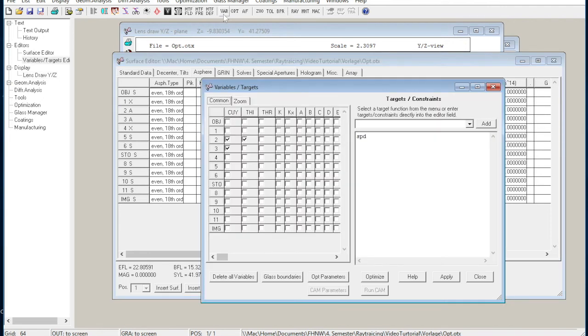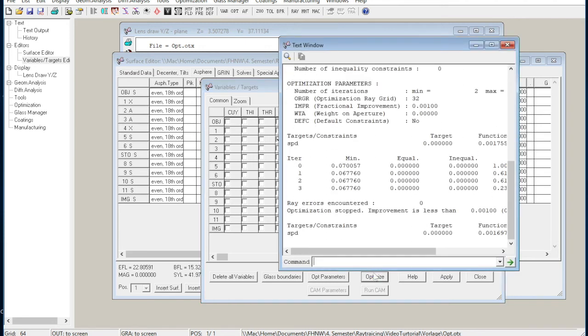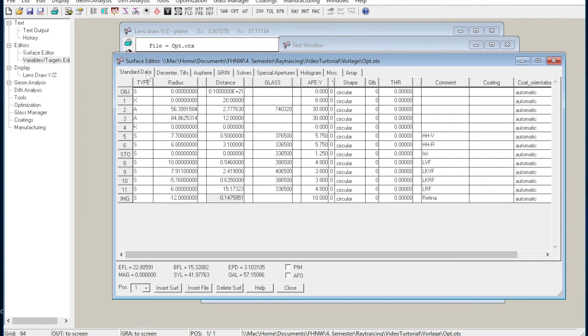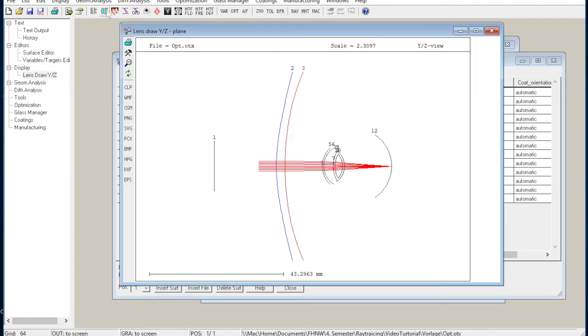Then again we click on VAR. You can't optimize both surfaces at once. The program has troubles calculating both surfaces together. So click on K for the first surface on number 2, then press again Apply and Optimize. Now you can see the changed value here and also the changed radius here. You can see it too on the picture that the front surface is flatter than before.